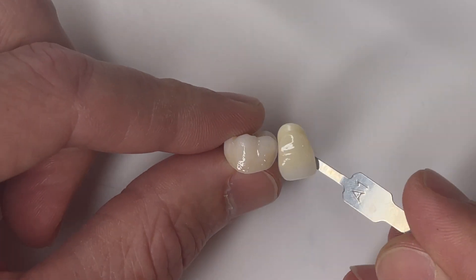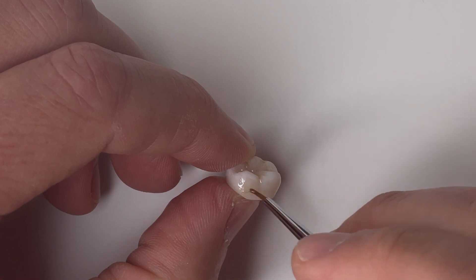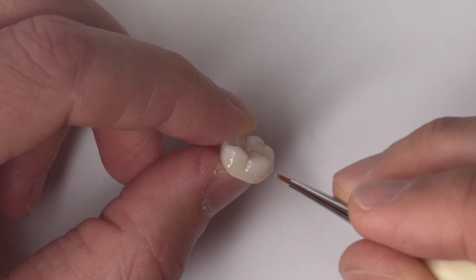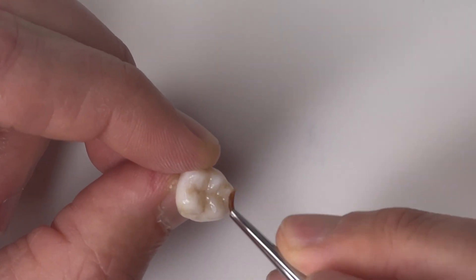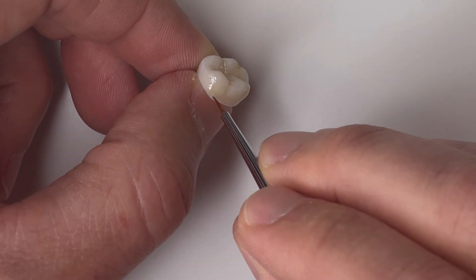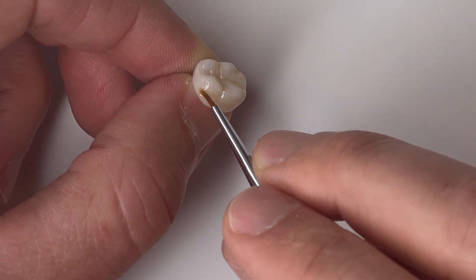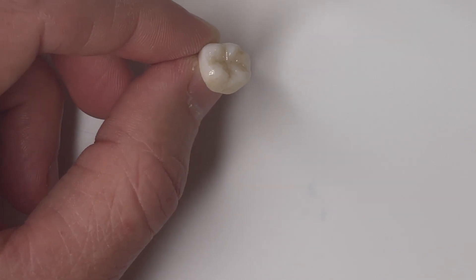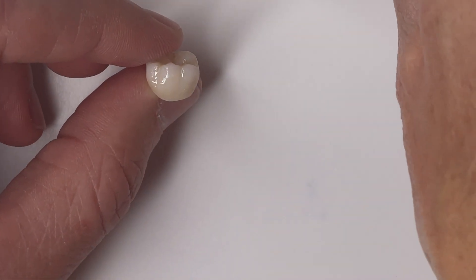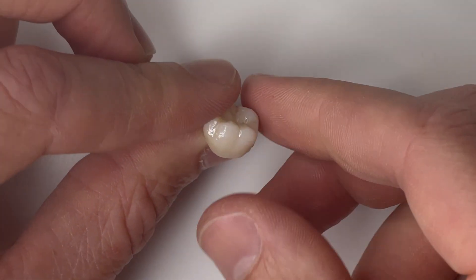This is not difficult with A Plus — they really make it simple. Checking that shade tab to see how we're doing, and we're getting pretty close. You just continue to add little by little until you get to your intended target. Especially when you're using a bleach shade as your base, you should at some point add some of this A Plus to every single part of that restoration. You don't want any one part being too high in value or too low in chroma. It's starting to look really good and very close.